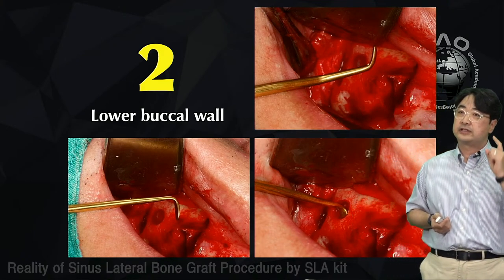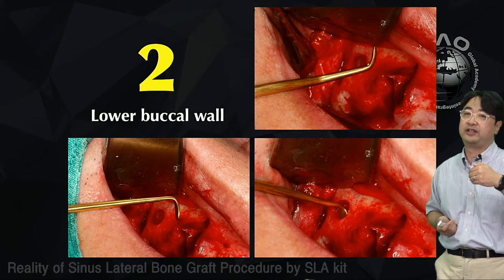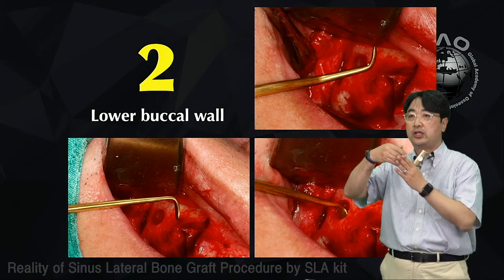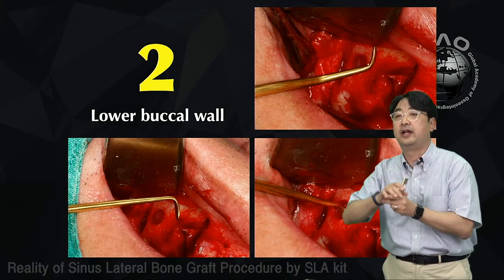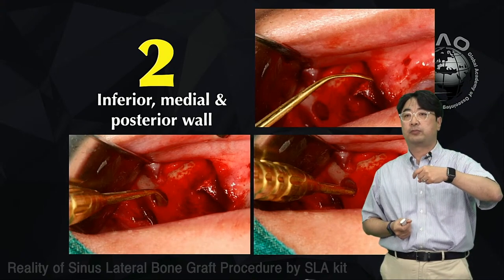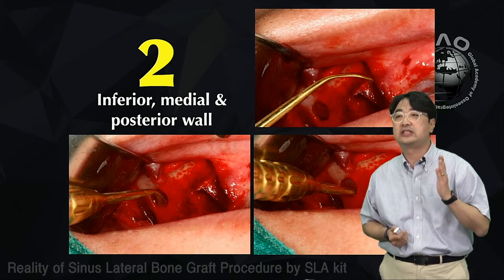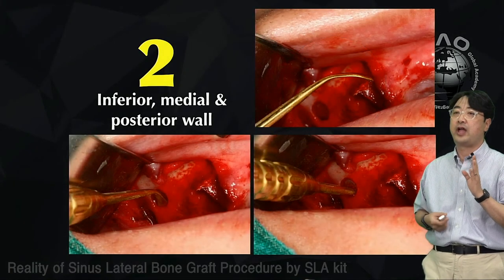The first time, you use the rectangular part of the number two Freer elevator. It means you go down from the window that you opened, down to the crestal, right? So this is how it works. After you finish with the rectangular part of number two, use the wider part to move farther. This is a very important tip.